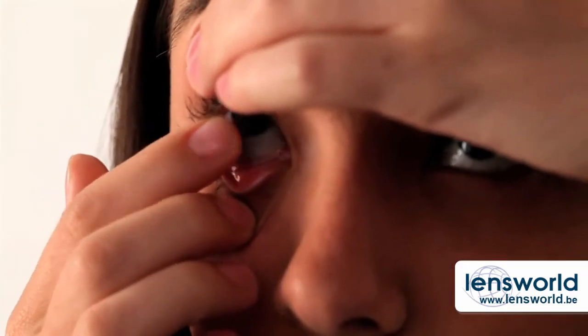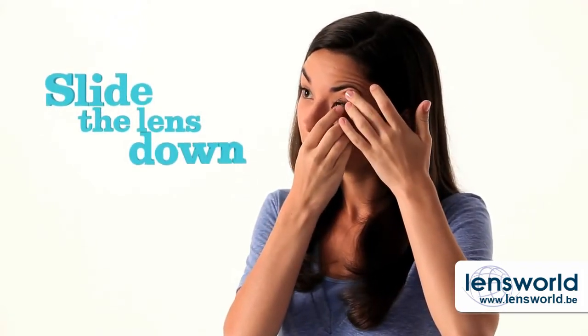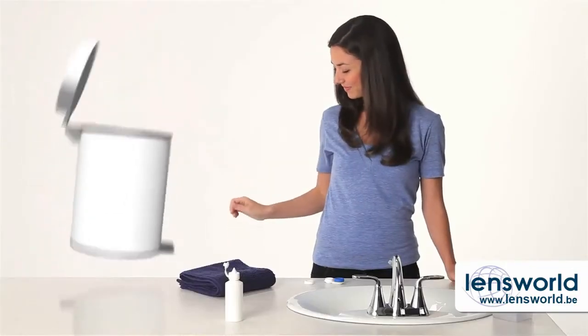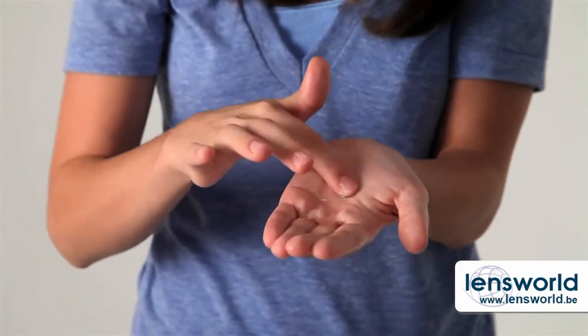Look up and pull down your lower eyelid. Bring your index finger close to your eye until you touch the lower edge of the lens. Slide the lens down to the lower right part of your eye. Gently squeeze the lens between your thumb and index finger and remove it. If you're wearing one-day lenses, just toss them out. If you're not, follow your doctor's instructions on how to clean them before putting them in the case.